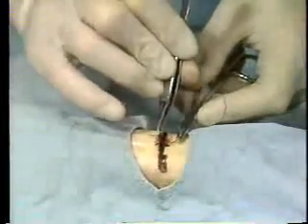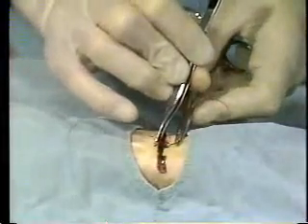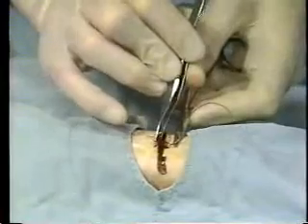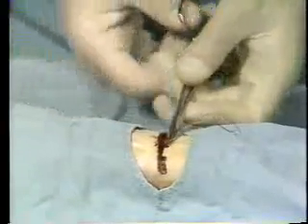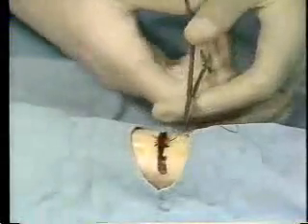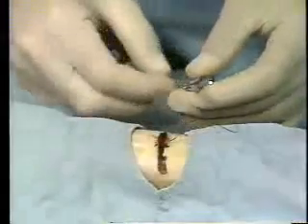Using the curvature of the needle, aim the needle upwards from the bottom of the opposite skin edge and puncture the uppermost skin surface, also 1/8 of an inch away from the edge. Continue to use the forceps to separate the skin layers.